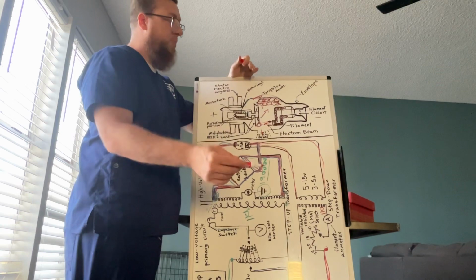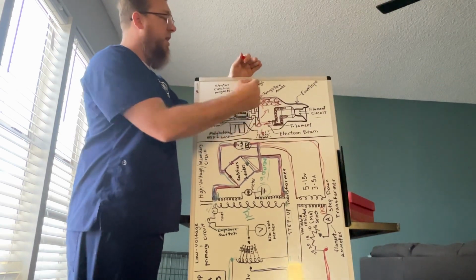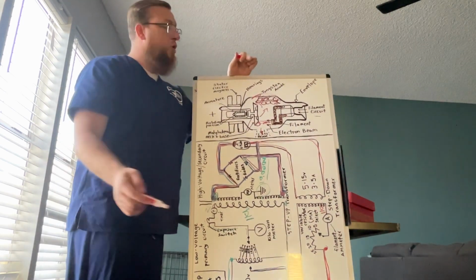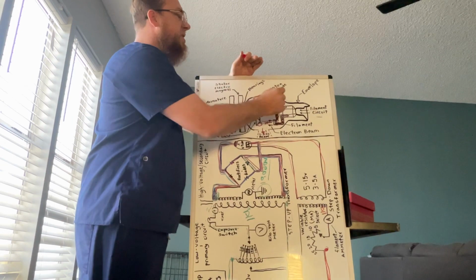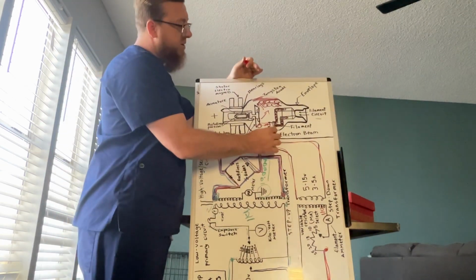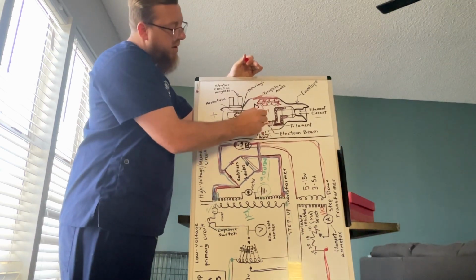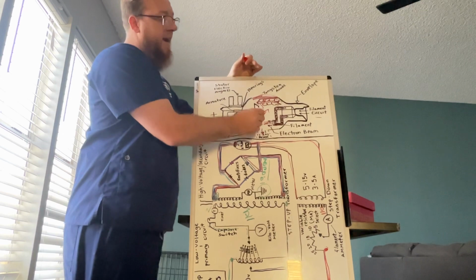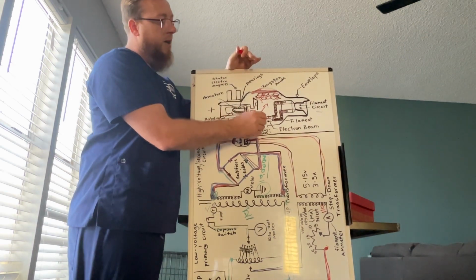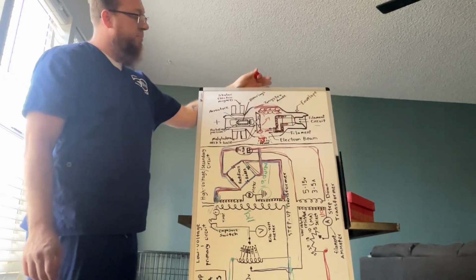If it gets to a certain point where it's just too many, it could actually break the glass, the Pyrex glass, break the envelope. The metal is used because the metal is stronger, so it lasts longer. But once thermionic emission is released, it's going to hit our anode at the angle. They're going to ionize, and that's what's going to create our X-ray photons, and that's going to create our X-ray beam. And that is the end of my presentation.